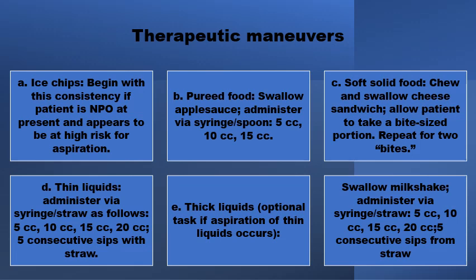There are other swallowing strategies and swallowing advice that can be given to the patient and tried in the last step of the flexible endoscopic examination of swallowing. Things like trying to start the meals with ice chips or ice cold beverages to give the maximum sensory input, or trying variations in the consistency of the food or the beverages to prevent aspiration, starting with a very small size of the bolus and going up gradually, repeating the thing with soft solids or with thin liquids or thick liquids as well. Various things can be tried at the last step of the FEES examination to see if this is going to help with the swallowing and also prevent aspiration.